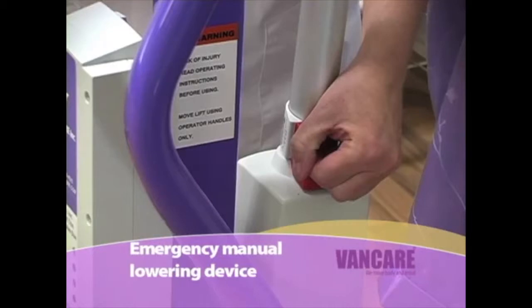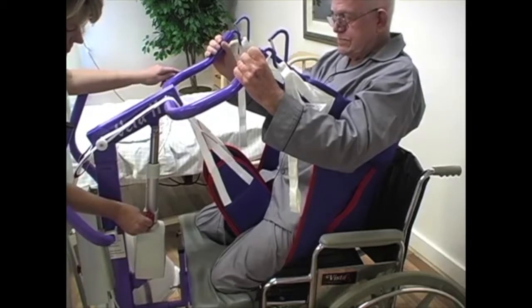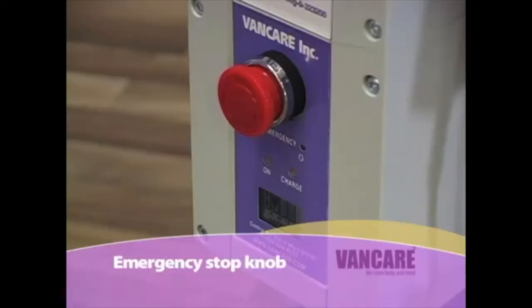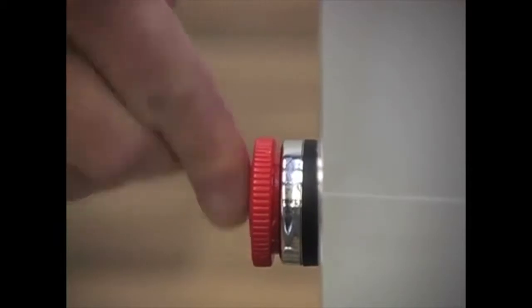Emergency manual lowering device. In the unlikely event the pendant switch fails at the same time the emergency lowering switch fails, a red emergency lowering device is located on the top of the actuator motor. Pull on the device to lower the client. Note the lift lowers very slowly. Emergency stop knob: A red emergency stop knob is located on the back of the battery control box. If the hand control fails and the lift continues to raise or lower, push in on the emergency stop knob to stop the lift.